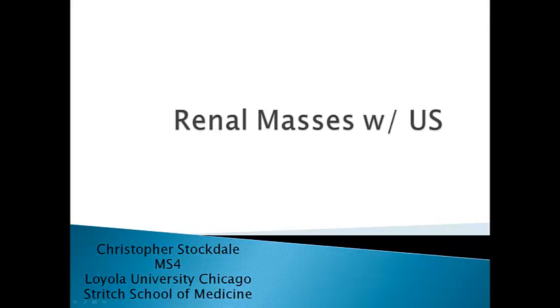Hello, my name is Christopher Stockdale. I'm a fourth year medical student at Loyola University Chicago. I'm currently taking the emergency medicine ultrasound elective, and today I'm going to be talking about renal masses with ultrasound.